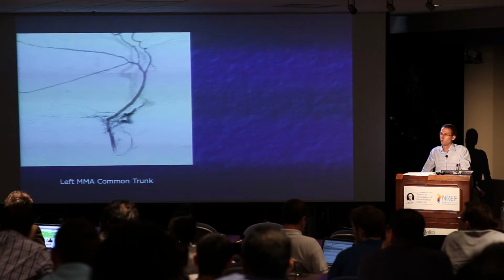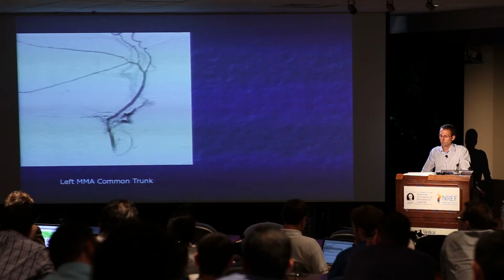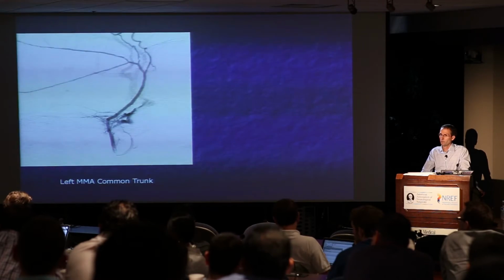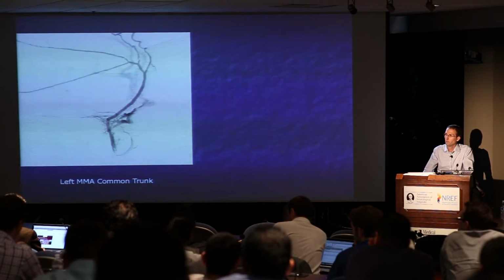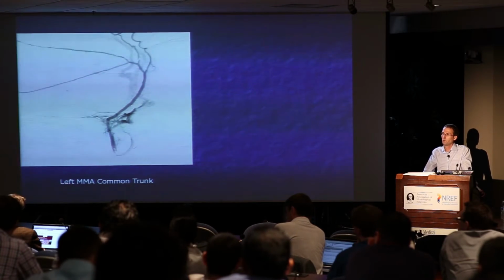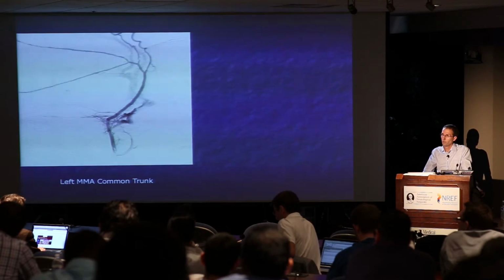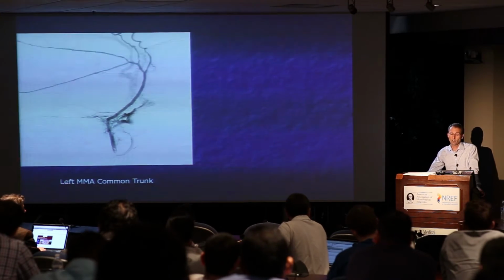Yeah. And I will beat myself up for missing exactly where the fistula is, where the extent is, and I am often frustrated when I'm left to clean up for somebody else doing the same thing. So as much as I have ADD, which I will admit, and want to move forward with treating whatever, this is where you've got to slow down and be patient and analyze, as Joey is telling you. That's the mistake you will make. I'm telling you, you will neglect to fully analyze, look at every view, look at every injection, and you will hate yourself for it. Yeah, so I totally agree with that.